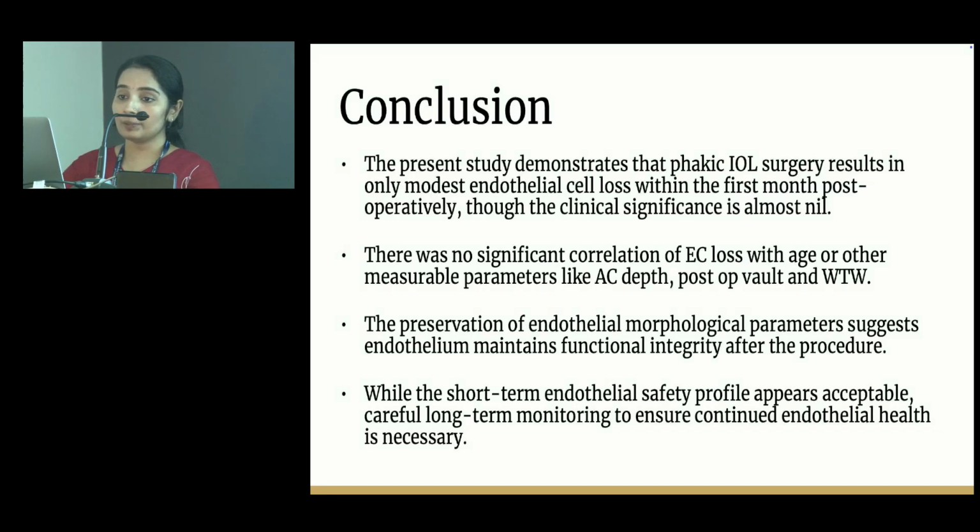To conclude, the present study demonstrates that phakic-IOL surgery results in only modest endothelial cell loss within the first month postoperatively, though the clinical significance is almost nil. There was no significant correlation of endothelial cell loss with age or other measurable parameters like AC depth, post-op vault, and white to white. The preservation of endothelial morphological parameters suggests endothelium maintains functional integrity after the procedure.